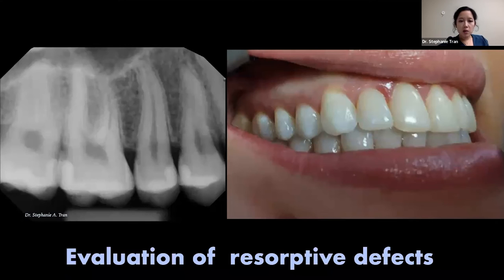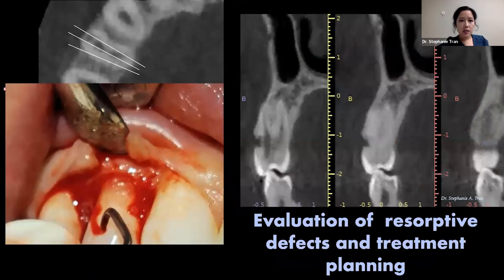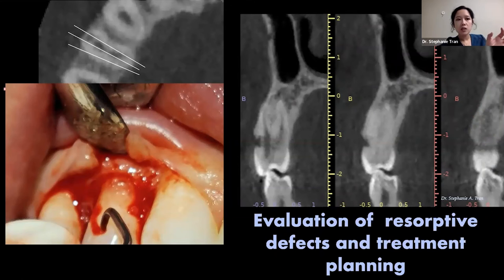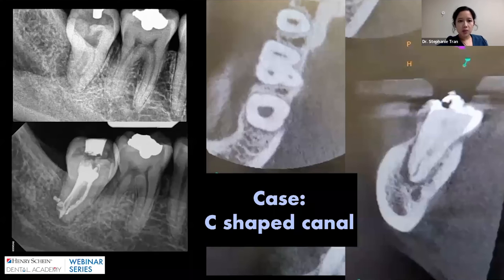Other resorptive defects, though, are much more localized. In this case, we can see that little radiolucency right at the cervical level — very clear and concise. A CT is still necessary to see how extensive it is. And we can see here that the CT shows it's nicely localized right at the cervical area, just barely approximating the canal and not extending all the way up and down the root. It only stays right at that cervical area, which tells me it was very treatable.